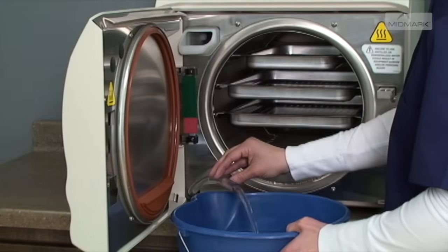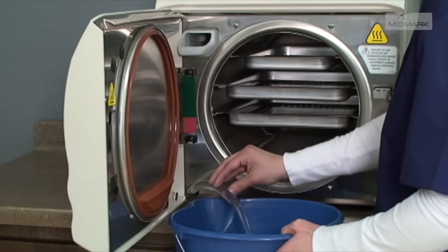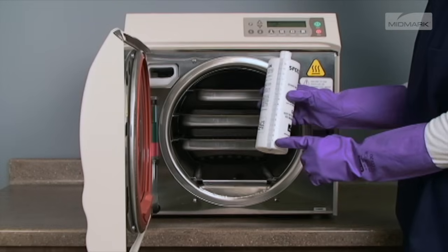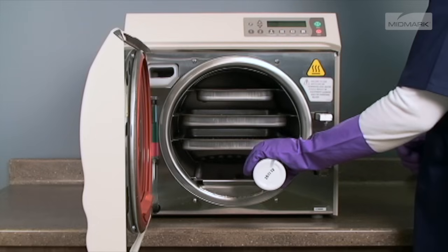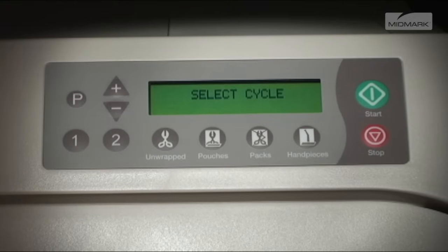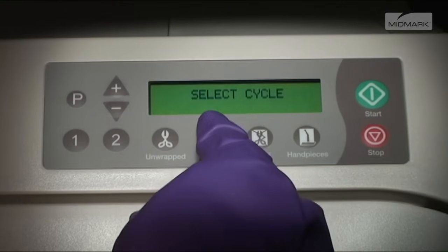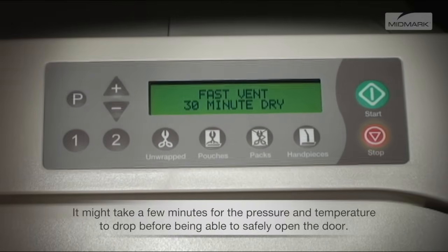Clean the chamber and plumbing. With a cool chamber, drain the autoclave's reservoir and refill with distilled water. Add one ounce of SpeedClean autoclave cleaner directly to the cool chamber — this is where you load your instruments for sterilization. Run one pouch cycle, but push the stop button when the drying cycle begins. It's not necessary for the dry cycle to run during this maintenance.